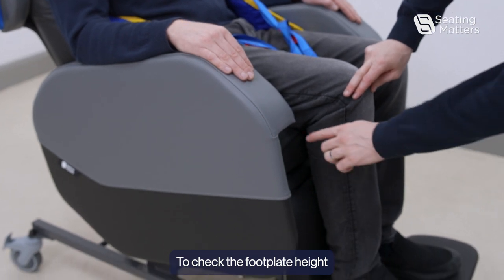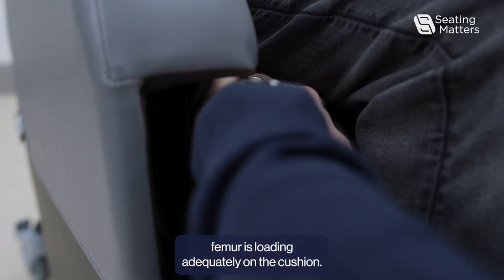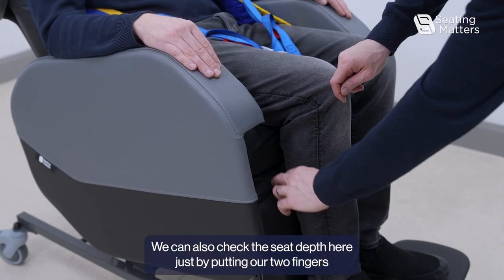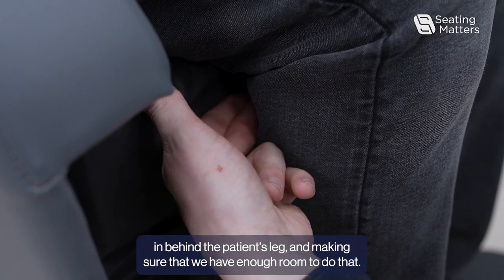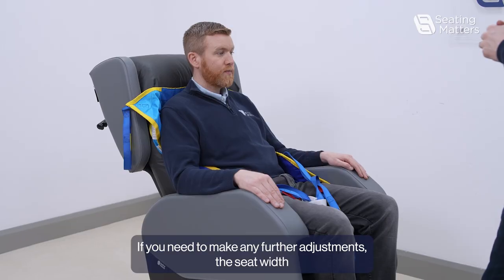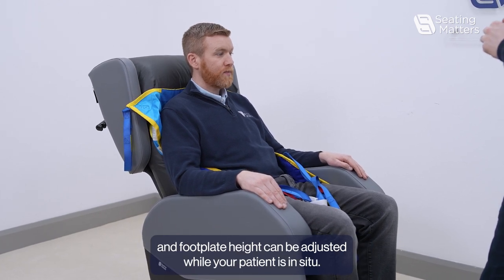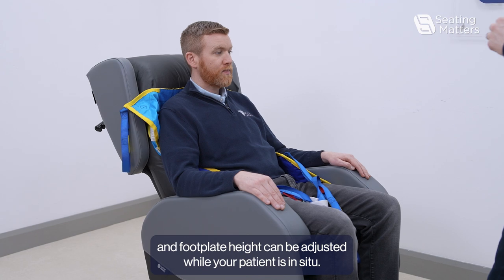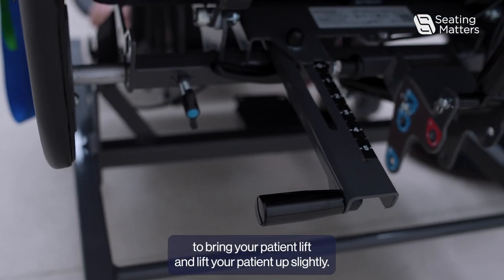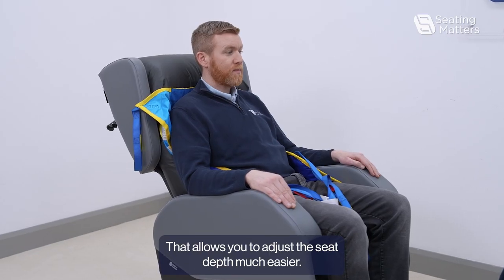To check the foot plate height, what we want to do is just make sure that the patient's femur is loading adequately on the cushion. We can also check the seat depth here just by putting our two fingers in behind the patient's leg and making sure that we have enough room to do that. If you need to make any further adjustments, the seat width and foot plate height can be adjusted while your patient is in situ. If you need to adjust the seat depth, it is good practice to bring your patient lift in, lift your patient up slightly. That allows you to adjust the seat depth much easier.